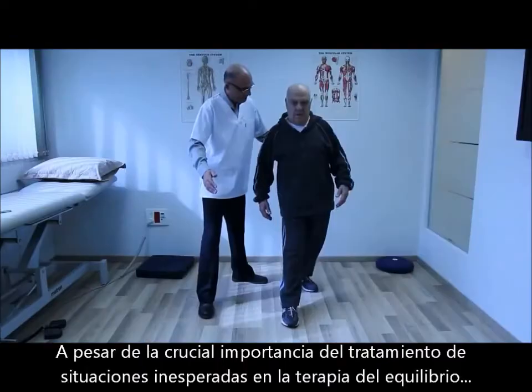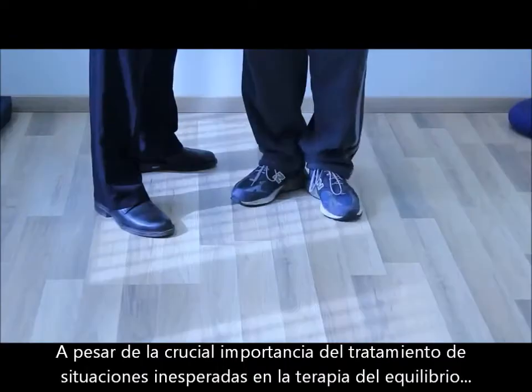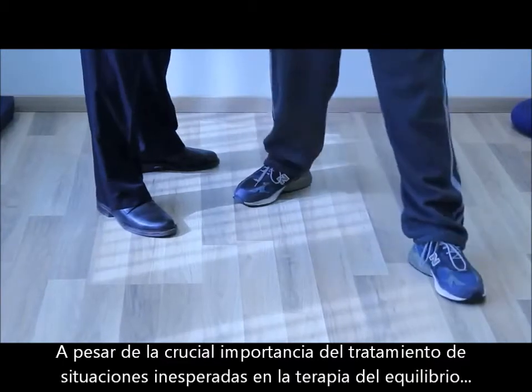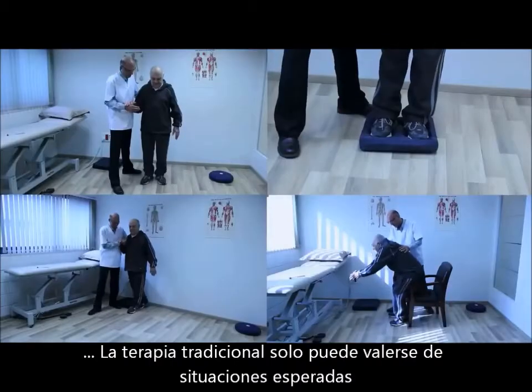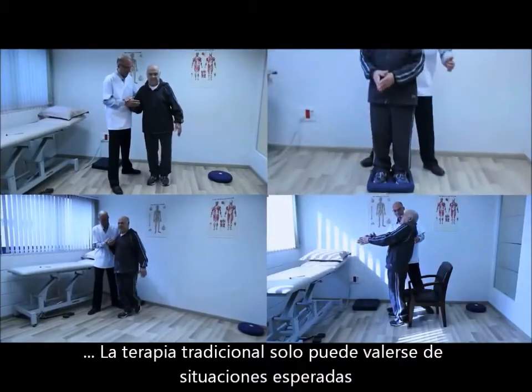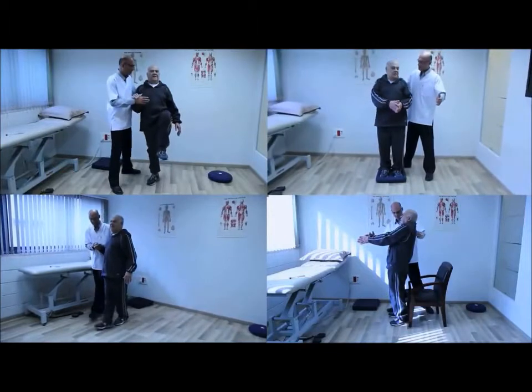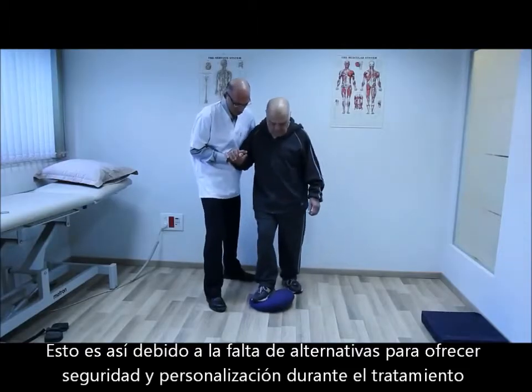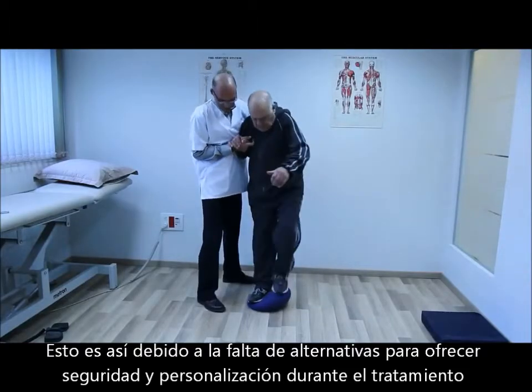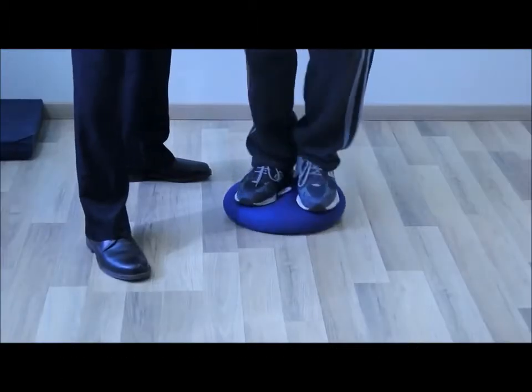Despite the critical importance of unexpected perturbation in balance therapy, traditional therapy can only use expected perturbation. This is because of the lack of both safety and treatment customization possibilities.